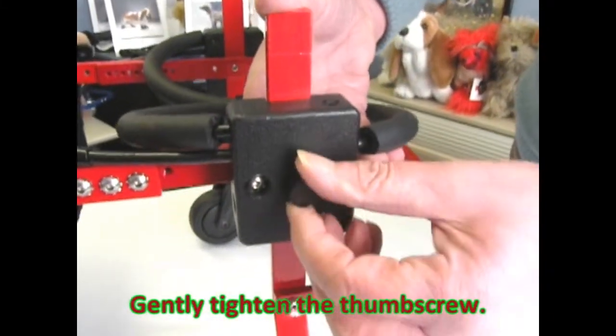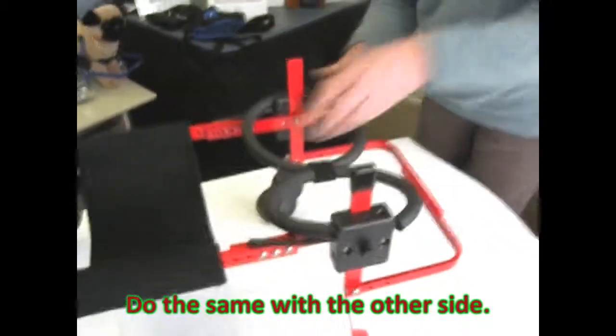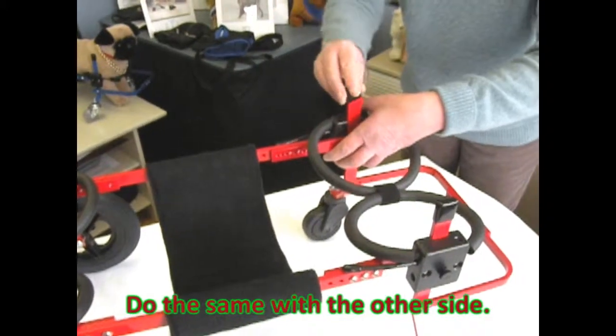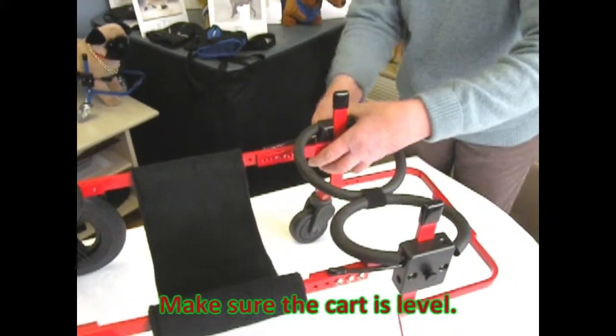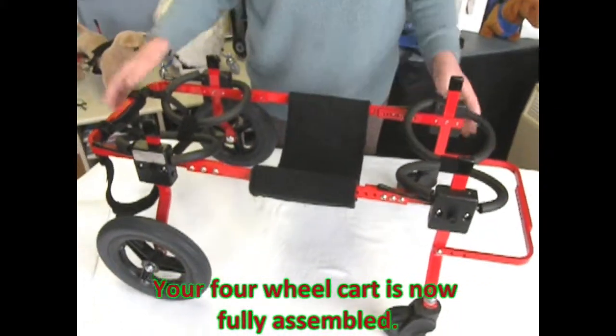Gently tighten the thumb screw. Replace the black cap. Do the same with the other side. Make sure the cart is level. Your four-wheel cart is now fully assembled.